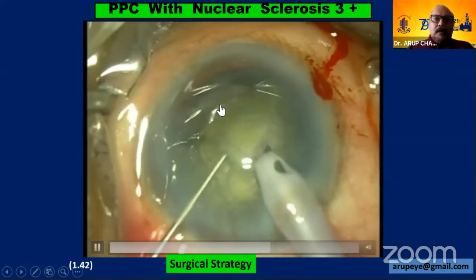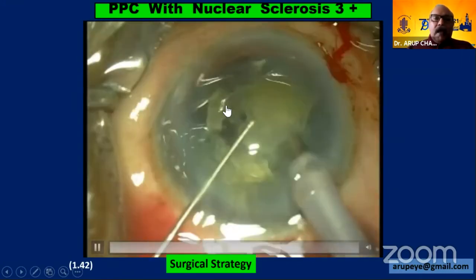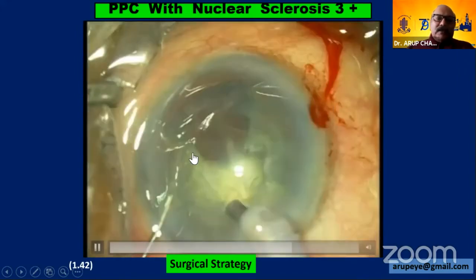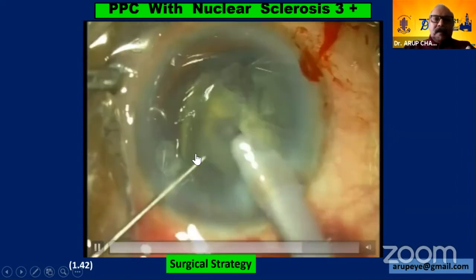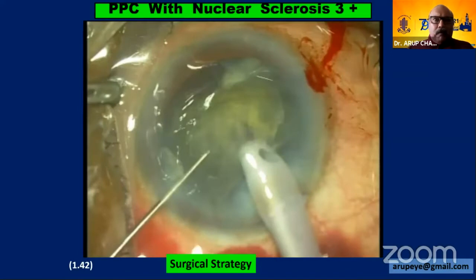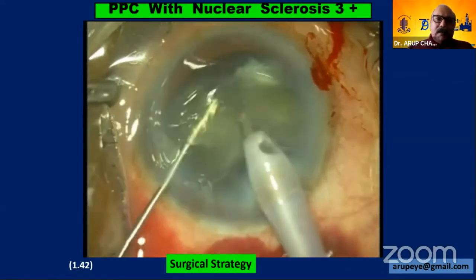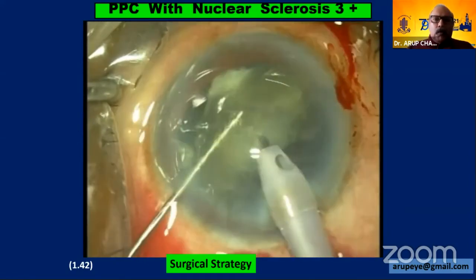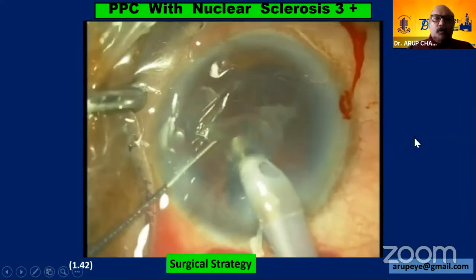This gives me a lot of space now in the central and inferior nasal capsular bag for me to manage the subincisional lens matter. For that, you can just lollipop the nucleus with the phaco tip, bring it into a more accessible area, and consume it with appropriate parameters. Of course, a few manipulations are happening in the anterior chamber at a more anterior level, and you need to protect the corneal endothelium with a dispersive OVD. So this patient goes off well.